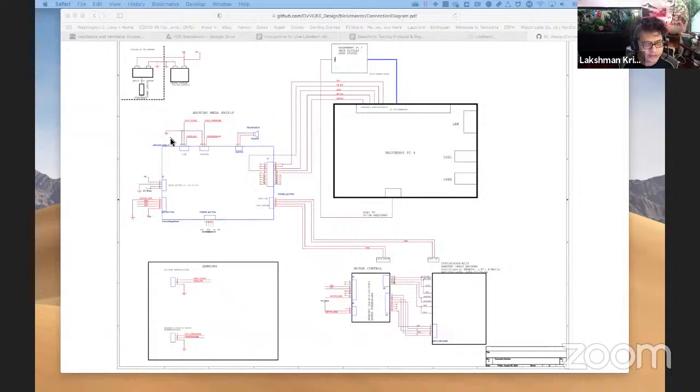You can look at the Arduino Shield. I'll describe the hardware and then we'll dive into the Arduino software. So we have the Arduino Mega, and there's a little shield which has connections to the pressure sensor, the flow sensor, the connection to the motor, Raspberry Pi, power button, the alarms, right? So it's a very simple shield that allows you to easily build the device.